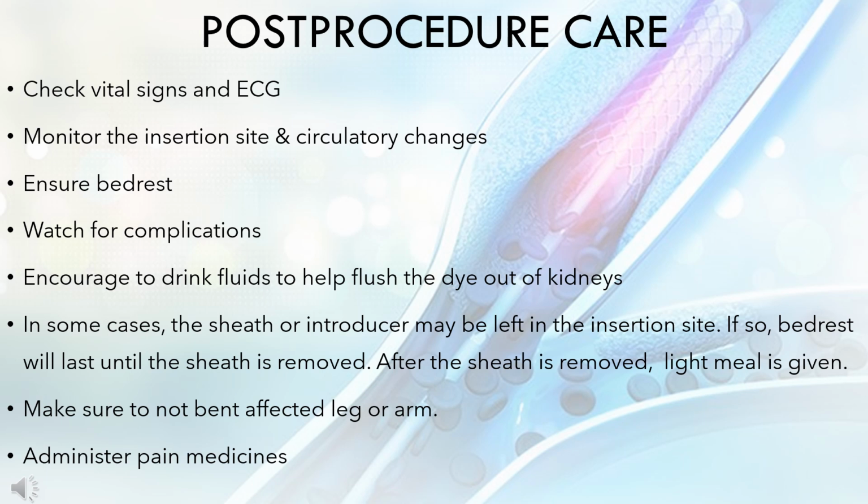Post-procedure cares of angioplasty are: check vital signs and electrocardiogram. Monitor the insertion site and circulatory changes. Ensure bed rest. Watch for complications. Encourage to drink fluids to help flush the dye out of kidneys.